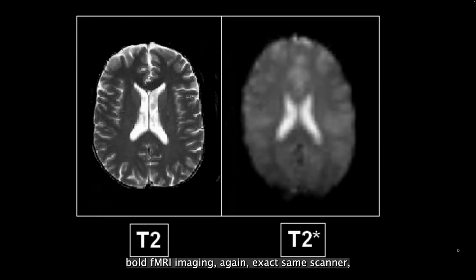Again, the exact same scanner. You could run this scan and then stop the scanner. You have this picture, and now set up the sequence slightly different. And now you have T2 star, and these are bold data.